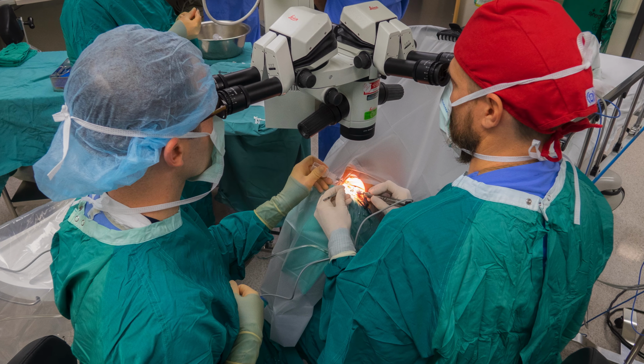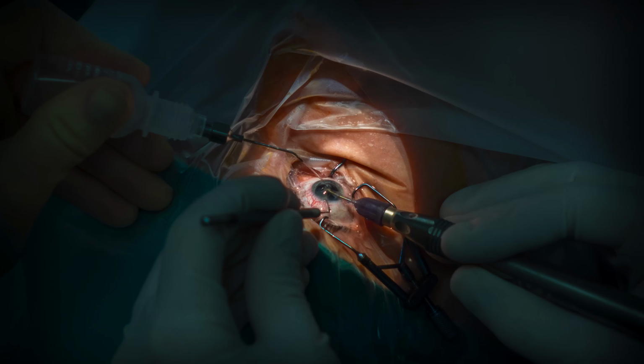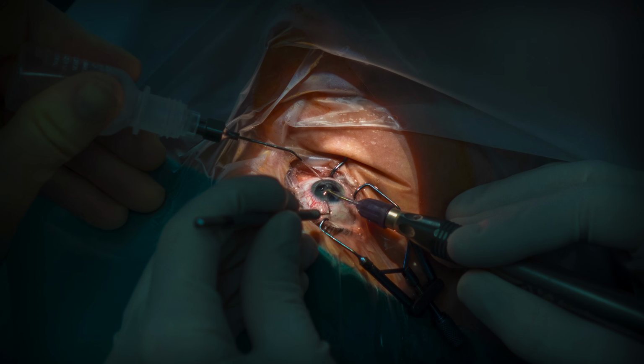When they realized that patients are awake during surgery, and they sometimes move and sometimes snore. Even a small amount of movement can cause severe damage to the retina. So they realized that there is a second part of the equation that others who are studying robotic surgery had not considered when it comes to retina surgery.